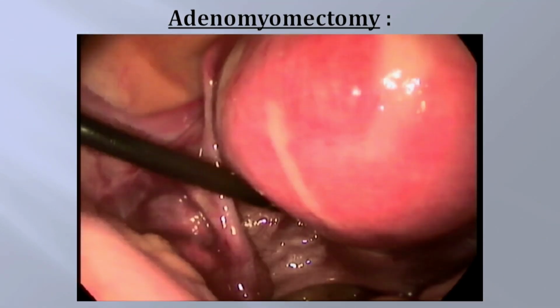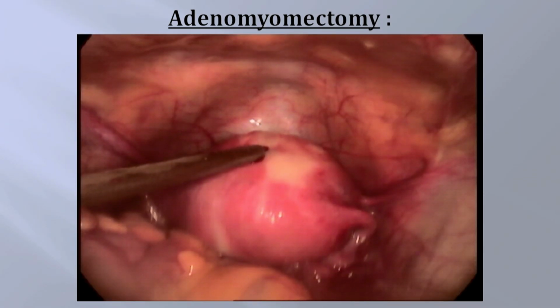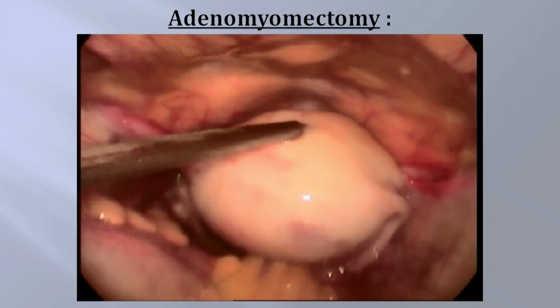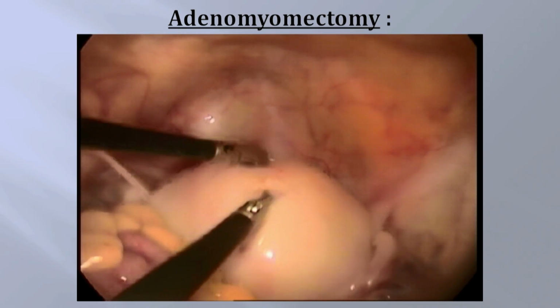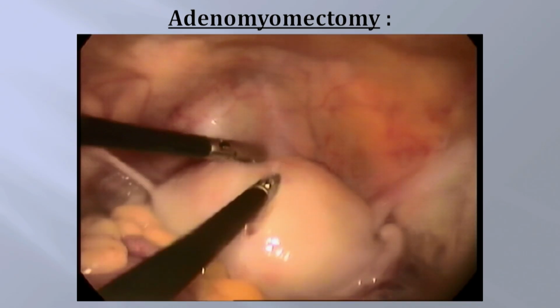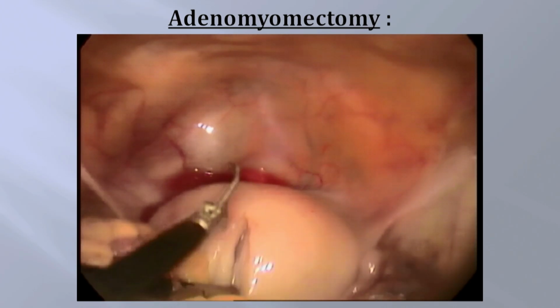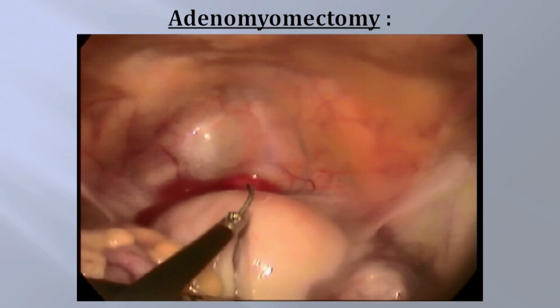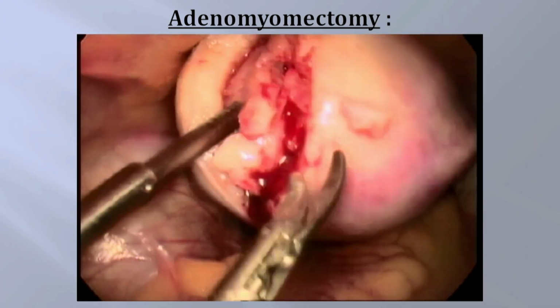Same way adenomyomectomy can be performed. Many of the times radiologists and even the gynecologists get confused with fibroids and adenomyoma. Here same injection vasopressin is injected, then a bold cut is made. It is a bit hard to cut adenomyotic tissue, because over a fibroid uterus you get the myometrium which is easily cut and then you can enucleate the fibroid, but the scenario here is different because all of that is myometrium which is hardened, and that adenomyotic tissue removal is a bit difficult.